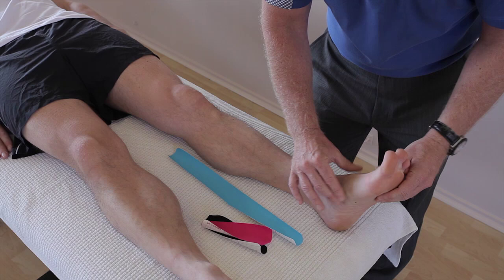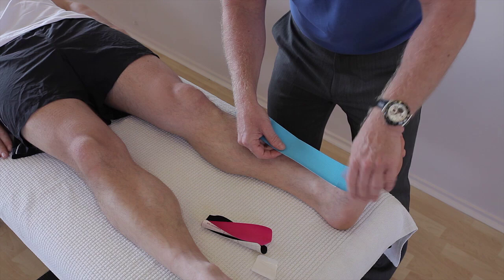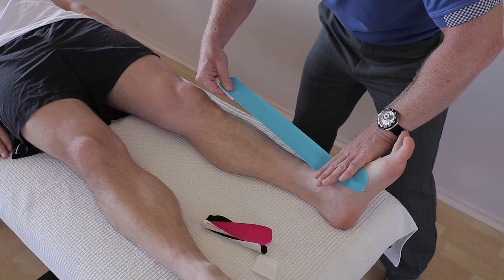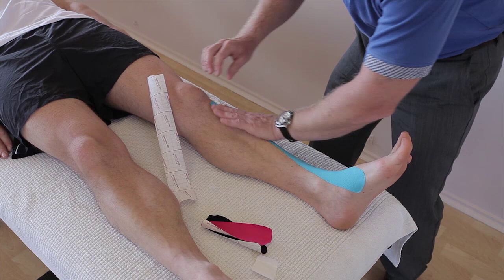For the first tape, split the first part and apply it towards the insertion, coming down to that part of the foot. Then peel back to the end and lay down the tape with little to no stretch — about 10 to 15% — covering the tibialis anterior muscle and molding it down. We've now covered the whole lateral part of the tibia, right up to the tibial condyle.